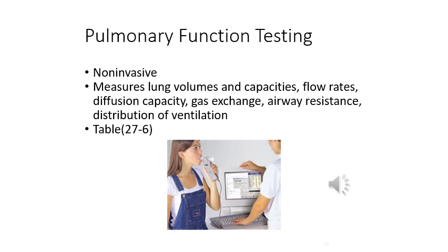Spirometry with a volume collecting device might be used. And then some tests, you can inform them, require you to breathe normally and quietly, and then others require forced inhalation and exhalation. So just kind of pre-warning them about what this test is going to include and entail.